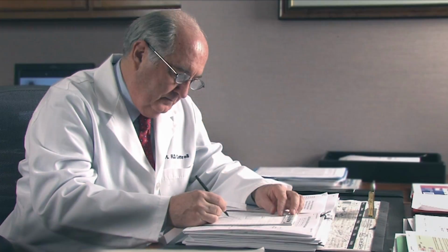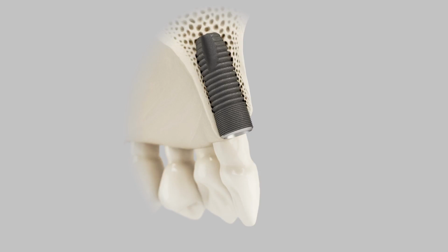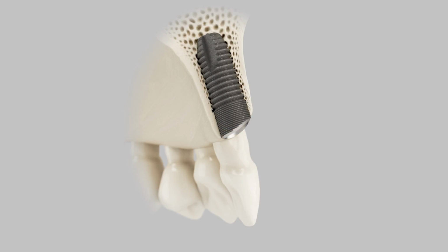Dr. Richard Cottrell, inventor of the sloped implant design, explains the rationale for following the contour of the bone. The profile implant encourages you to place the implant in the more correct axial position. It is unnatural when you have an implant with a flat top to put it in a sloping topography. And in fact, it's much easier to line up a profile fixture with a presenting anatomy than it is to take sloping anatomy and try and figure out where to put a flat top implant.